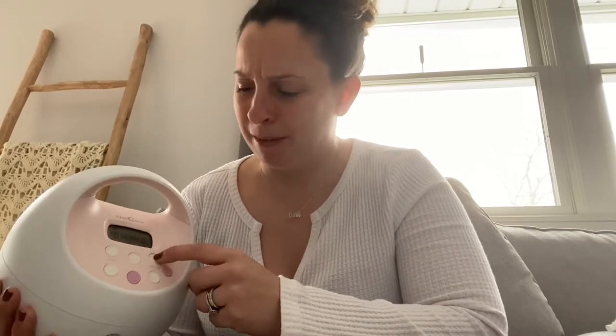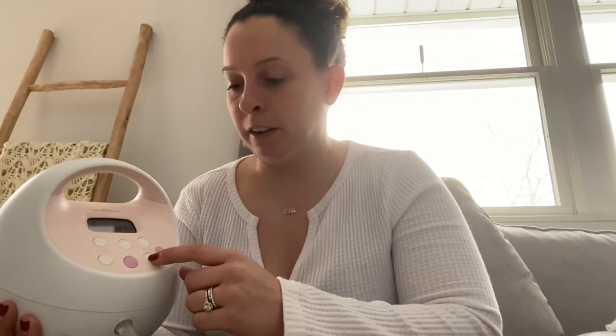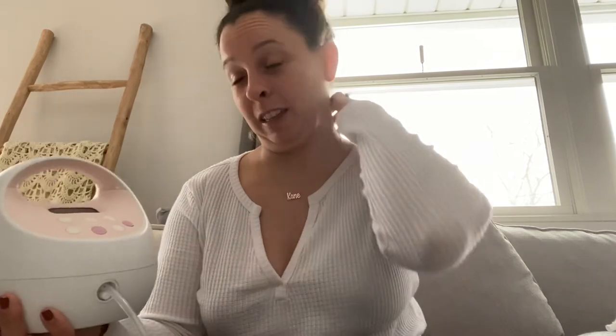After about two months I bumped my vacuum up to 4 — you can just hear the difference, it's a little bit more suction. So once your milk is really coming in and you're doing well you can mess around with the settings a little, but I really stayed with the initial settings for at least the first month and a half to two months that the lactation consultant told me.